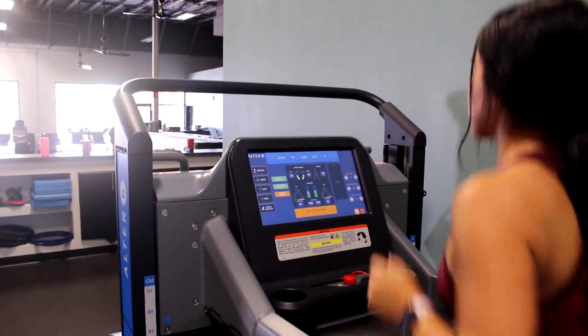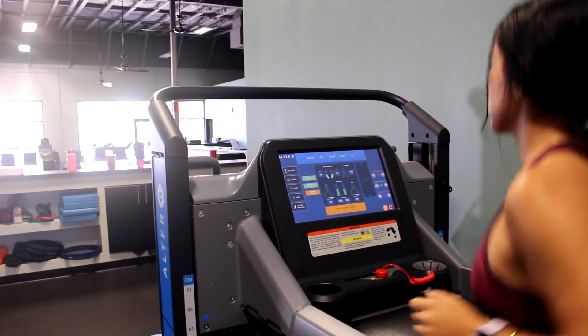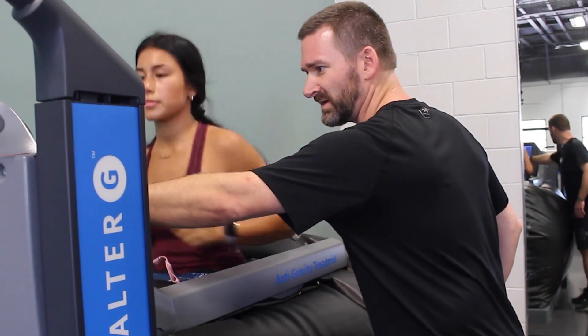Allowing you to recover more quickly. With the Alter-G treadmill, physical therapists and strength and conditioning coaches have seen increases in recovery and patients have seen less impact on their baseline fitness.